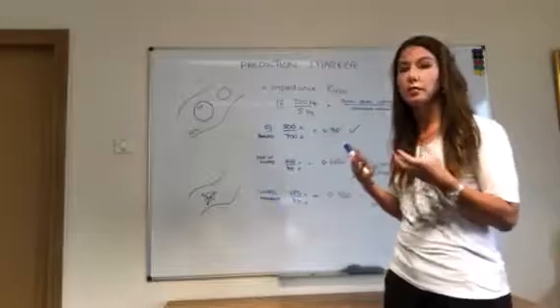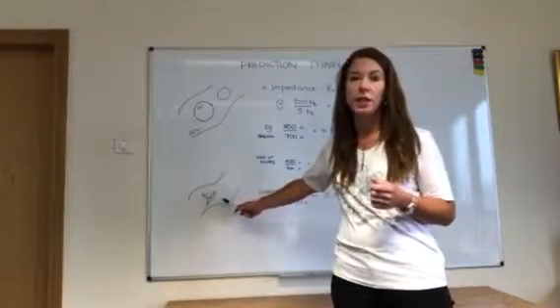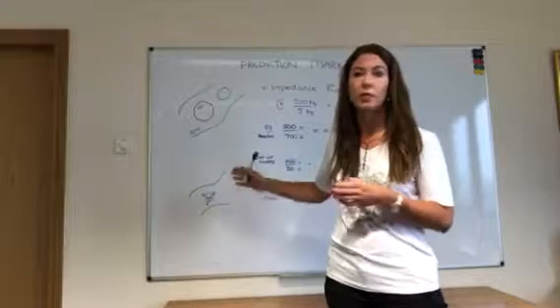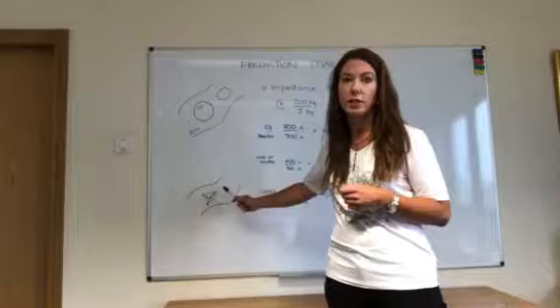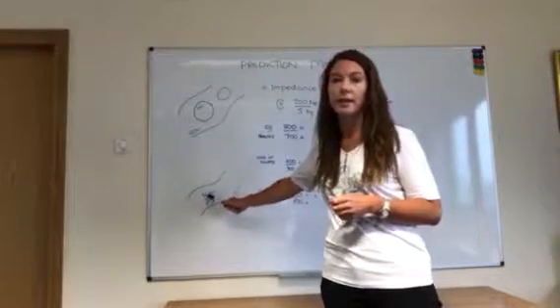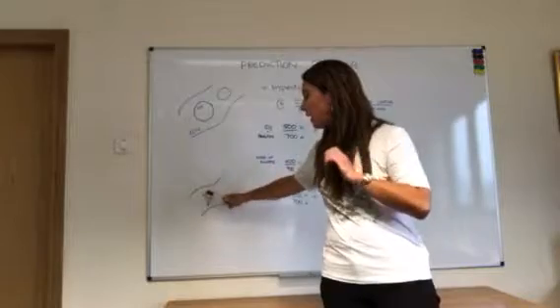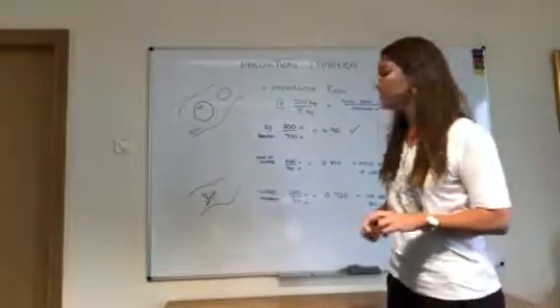But in signs of illness or early signs of lymphedema, the cell is not able to hold on to that intracellular water. There's cell leakage, the extracellular water is increasing, and the difference between the extracellular water and the intracellular water is much less because the cell is unable to hold on to that intracellular water. So you can see the cell membrane breaking down here and the water is excreting out of the cell.